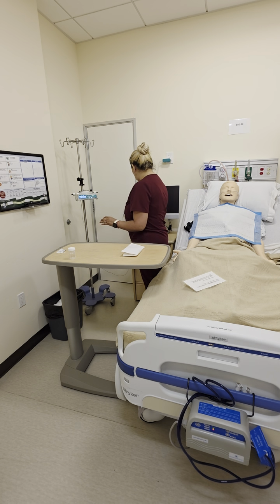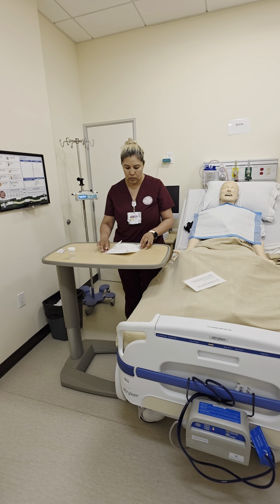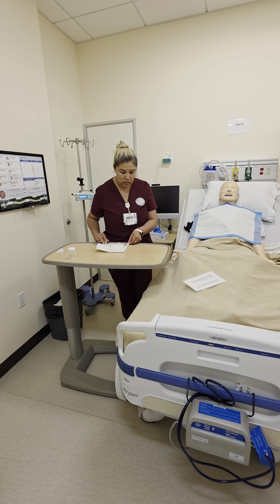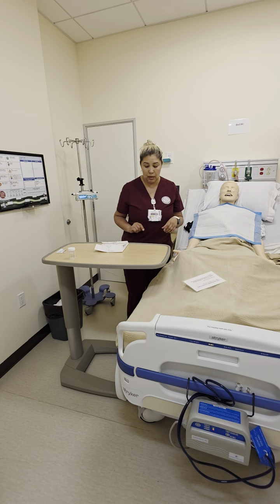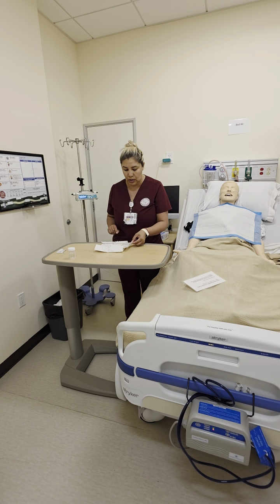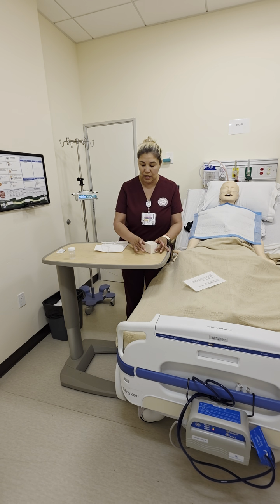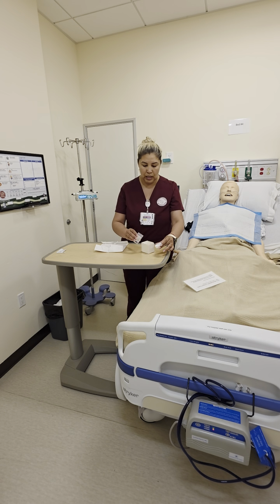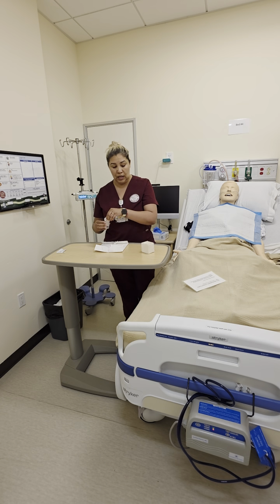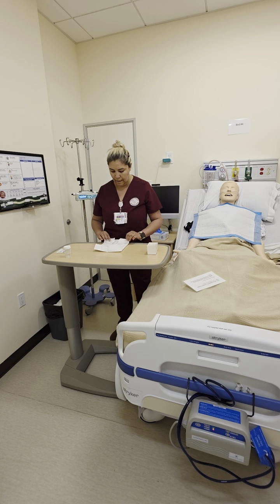Opening up my sterile field. I mentioned that I did pre-oxygenate my patient. I want to make sure that my patient is receiving enough oxygen, since I will be removing the nasal cannula as I'm performing the suctioning. Okay, putting in sterile water. The inside of the box is sterile, so I do not want to touch the inside.